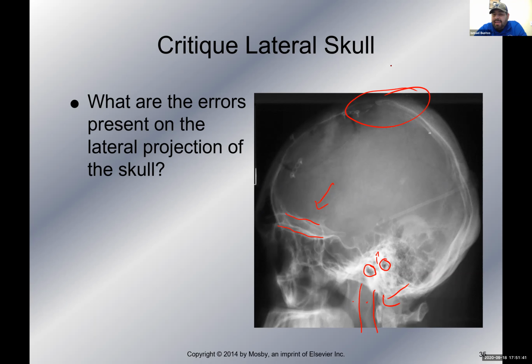Now, if you're saying foreign body or foreign substance, there is foreign substance or foreign bodies in there, but they are part of the procedure that was done to the patient. So this here is a tube kind of used to help relieve fluid or pressure inside the brain, okay? And then here are some hardware that has helped to hold the skull in place. You can tell that it was either opened on purpose or cracked, right? Because there's lines there. Right, tells you that it was opened up, so they might have done it to do some surgery in there. So they use those to hold it back in place. Okay, and that there is a catheter just to help remove some fluid or something in there.